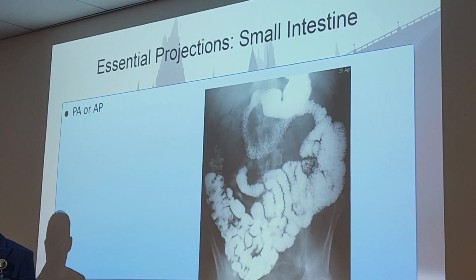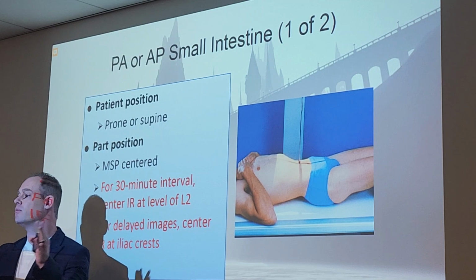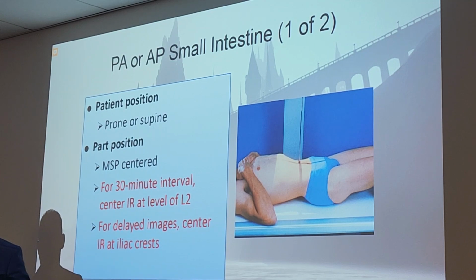All right. Boy, I love those projections. There's just one: PA or AP at timed intervals. That's your essential projection for the small intestine, small bowel follow through exams. So how do you do it? Prone or supine. Now for the 30-minute interval specifically, this is very important. This is the only thing that's a little bit different. For the 30-minute film, we're going to set the IR at the level of L2. Everything else, the scout, the first 15-minute film, and everything after the 30-minute film, we're doing all at the iliac crest, like a normal KUB. So everything with a small bowel is done like a KUB except for the 30-minute film.